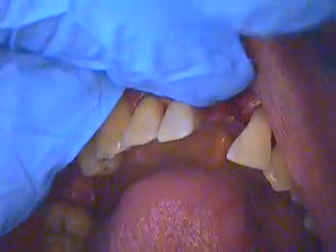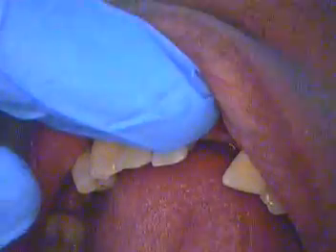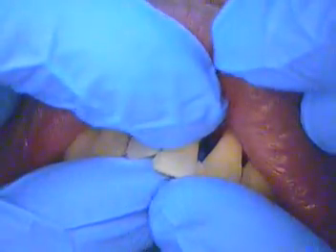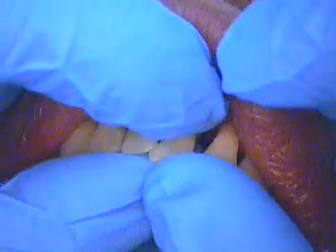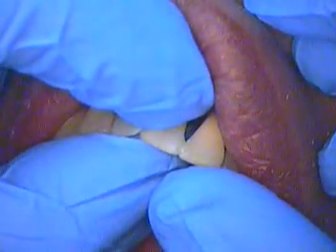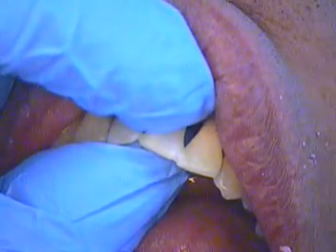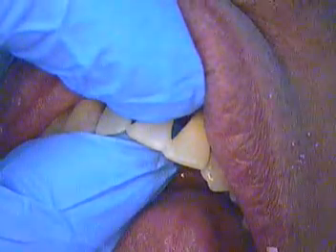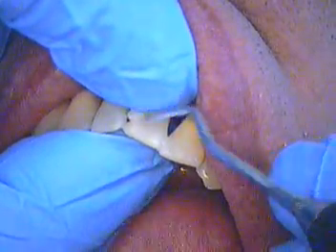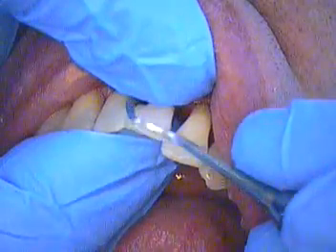Let's pick this thing up with an instrument. Hold on — it's sticking to the pad. We just want to tack it in place. You okay, Ernie? More bonding material, please. A1. Okay, you okay, Ernie? Okay, great. I just want to make sure we... let's just tack it in.